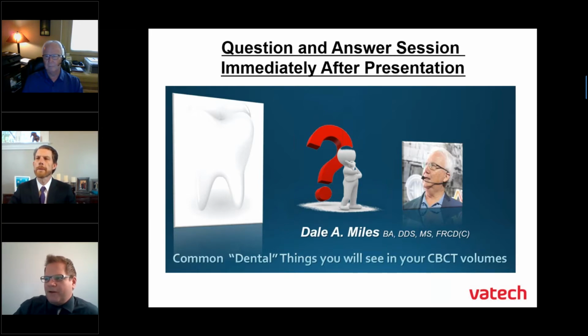Okay, another question here, also from Joseph. Do any radiopacities cause numbness of the inferior alveolar nerve? Alveolar, sorry. Anyway, not really. Pose that question again, because there was something else in there that I was going to address, and I forgot it by being cute there. Do any radiopacities cause numbness of the inferior alveolar nerve?